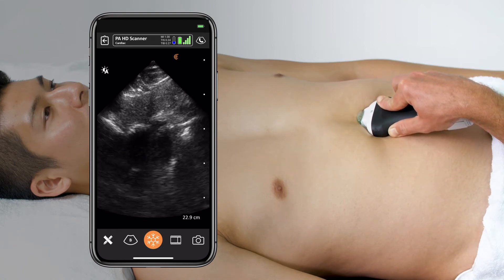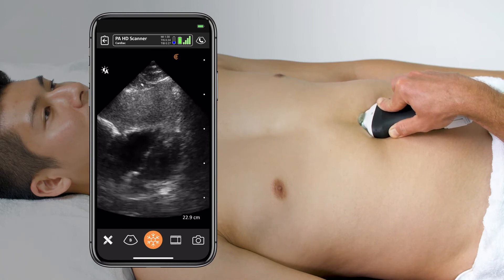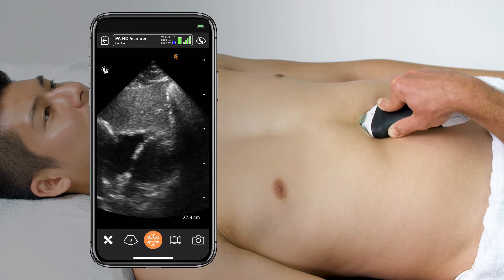Once the heart is in good view in the middle of the screen, start tilting or fanning the probe until all four chambers of the heart are visible.